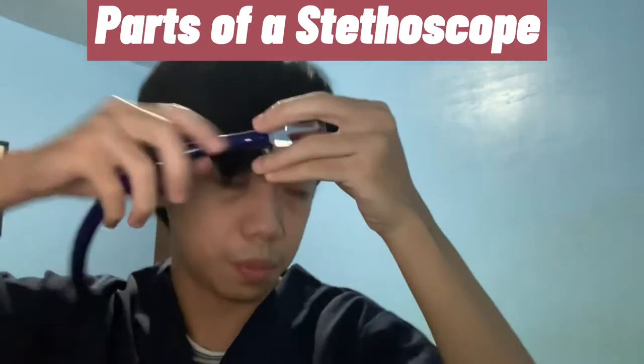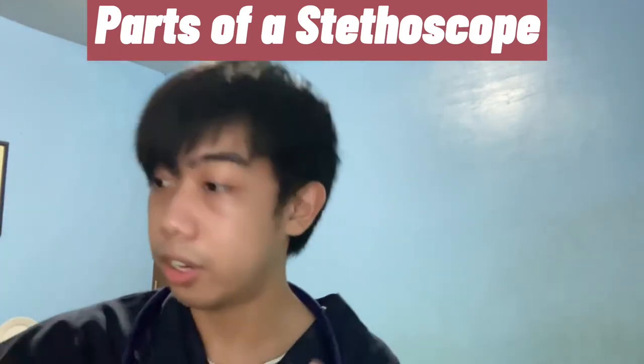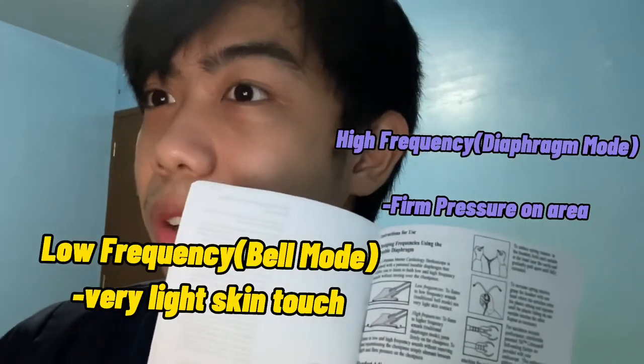For this type of stethoscope, we don't have a traditional bell like conventional stethoscopes — the bell is the back part. Instead, we only have the diaphragm. However, this diaphragm is a two-in-one. It uses pressure from the user to determine whether you're listening to low or high frequency sounds. It's a tunable diaphragm: light pressure gives low frequency, firm pressure gives high frequency — it depends entirely on the applied pressure.